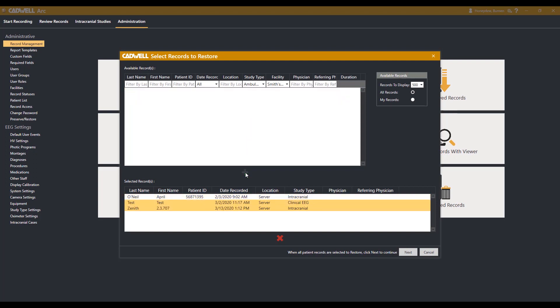If you would like to remove a record from this list, select the patients you don't want restored and hit the red X at the bottom. This will remove them from the restoration list.